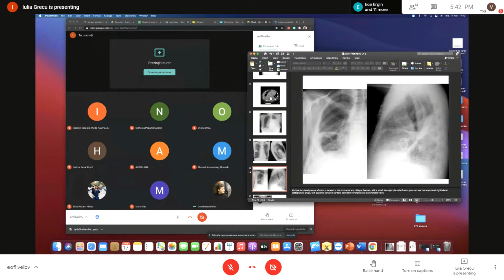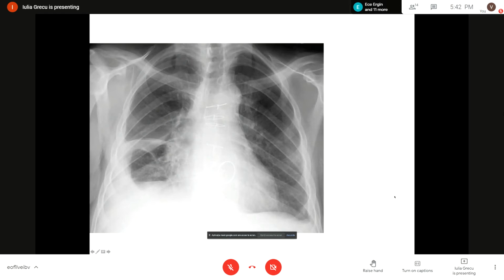But you will have to have a different kind of X-ray to analyze the thoracic spine. And hopefully you will learn much more MRI for this kind of pathology than X-rays, but well. So let's focus on the thoracic and pleural and pulmonary pathologies here.